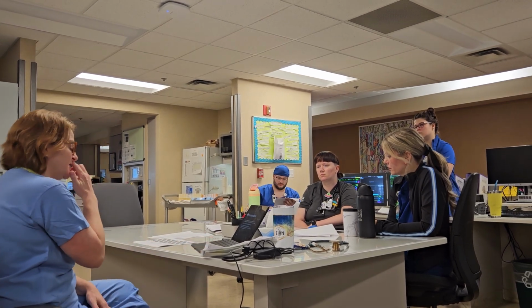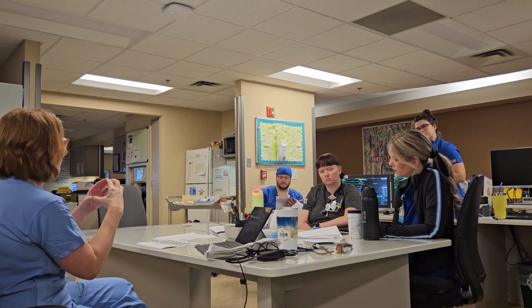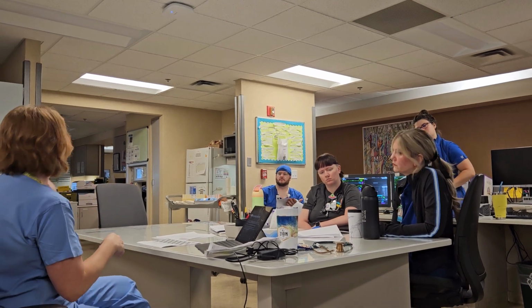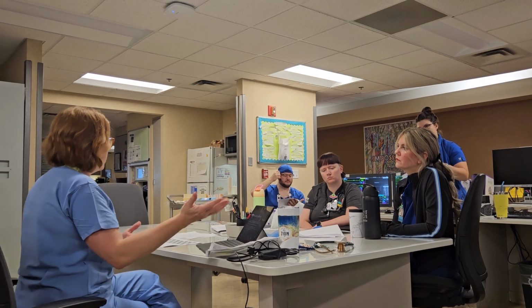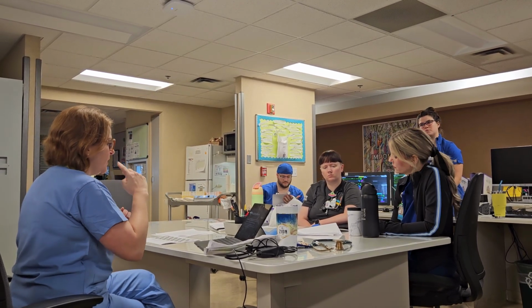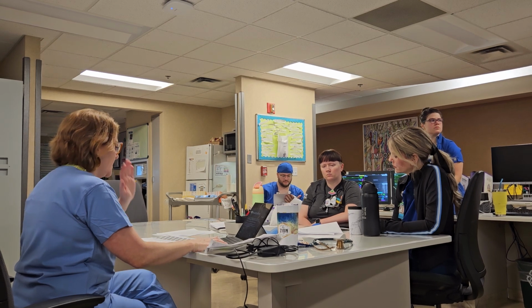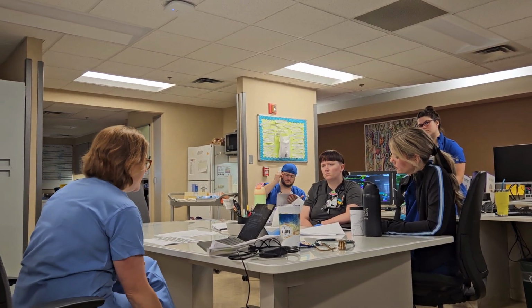Pressure control ventilation is just the exact opposite. We set a specific pressure that we want to see in the airways. The ventilator will deliver whatever volume the patient wants or that can be delivered based specifically on the pressure that we set. So the volume can change dramatically depending on what's happening with the patient in that case.